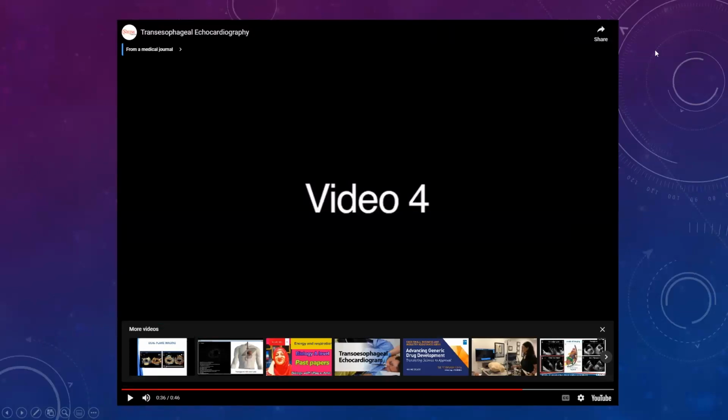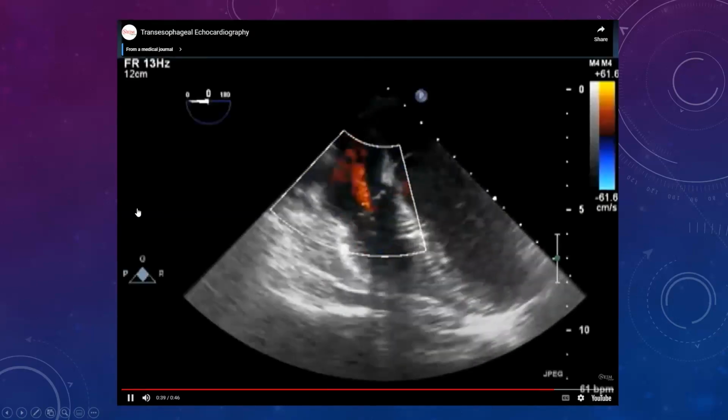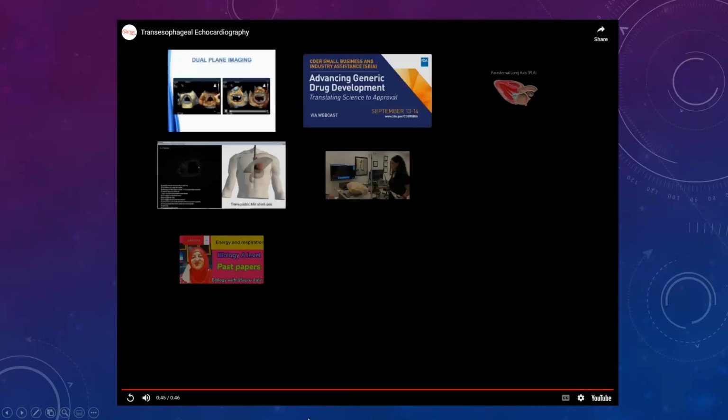Anyone? Bueller? PE. PE. That would absolutely be my number 1 diagnosis as well. You get that acute dilation of the RV and RV dysfunction. So now after they've treated the PE and actually put this patient on mechanical circulatory support, you see improvement of the RV as well as the tricuspid valve.